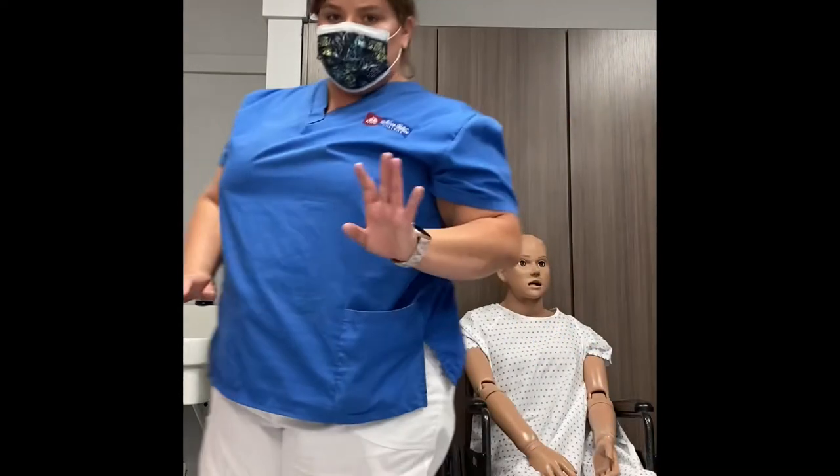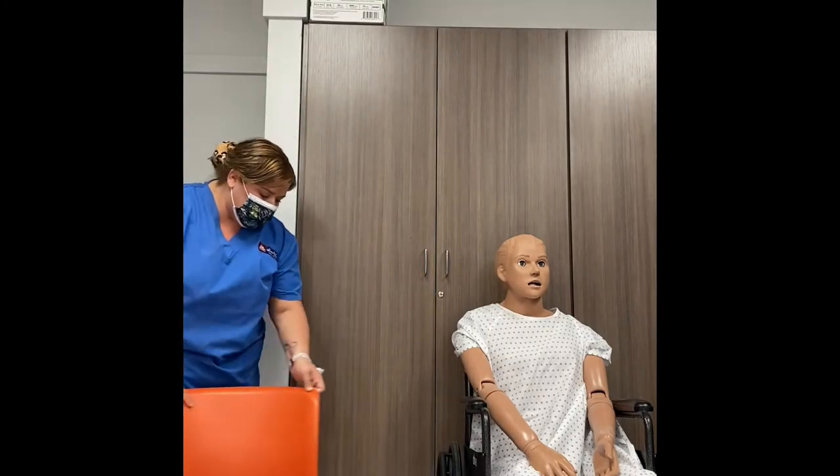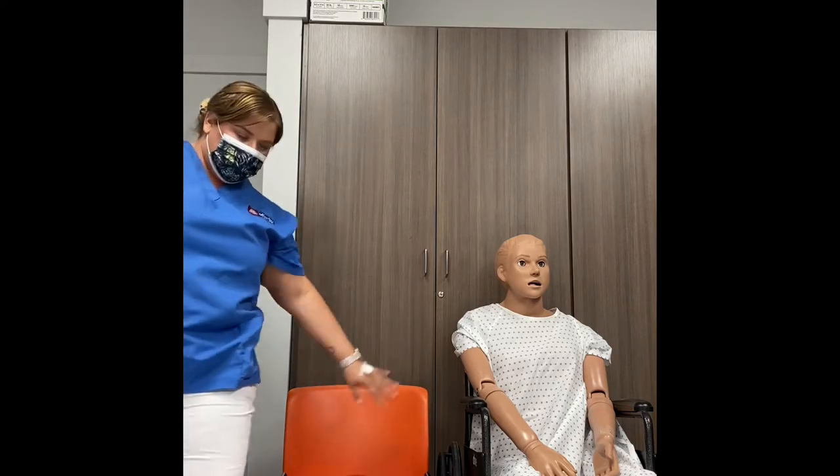After doing that, you're going to want to make sure that you bring the chair close to the patient. Go ahead and bring the stationary chair as close as you can to the wheelchair.